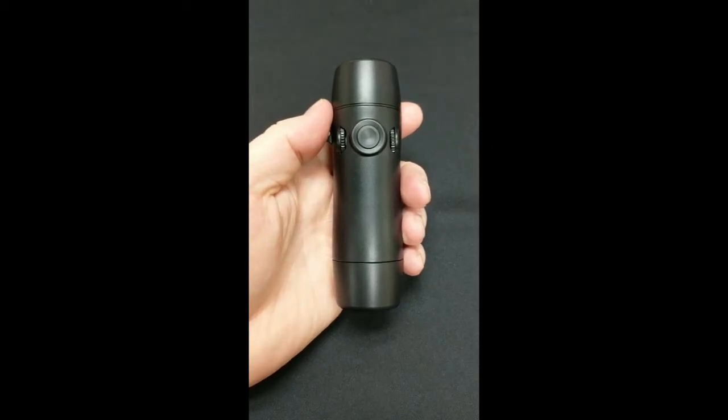Welcome to Griffin Laboratories' quick tips to better speech with your Truetone Emote Electrolarynx. This is Cliff, and in this video I'm going to cover the tone and volume adjustments.